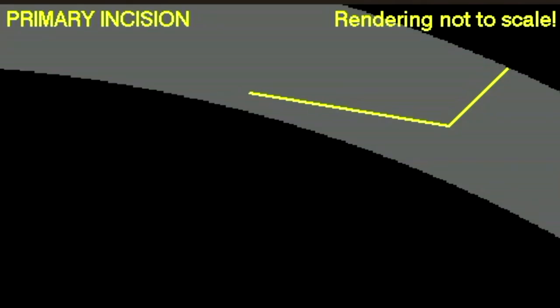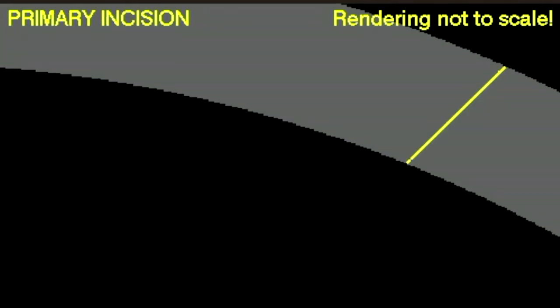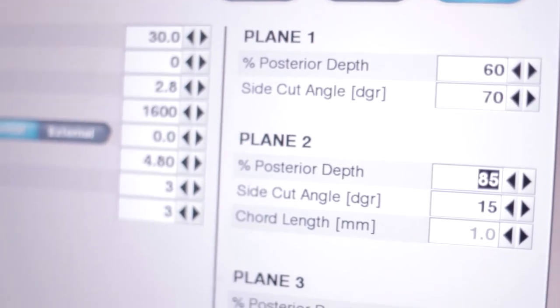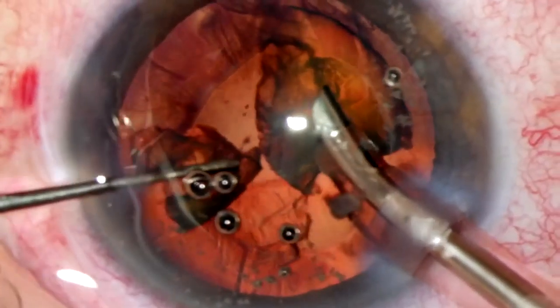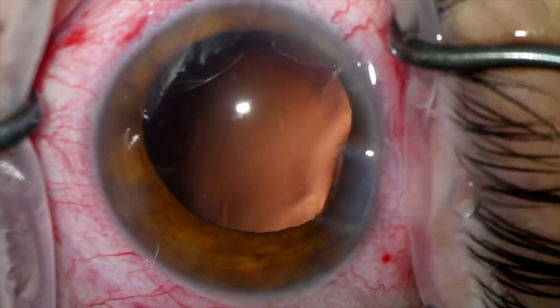Although it is possible to configure bi-planar or even single-plane incisions, a three-plane incision, in our opinion, allows for best stability and predictability of results, both during and after phacoemulsification.